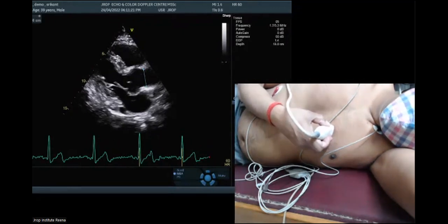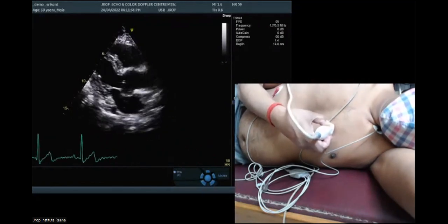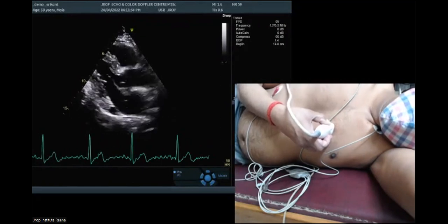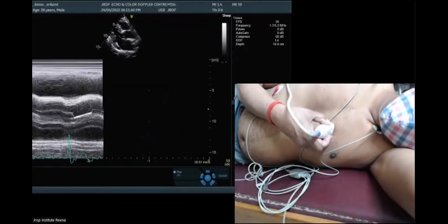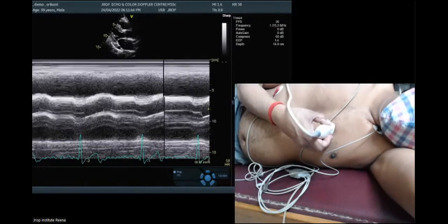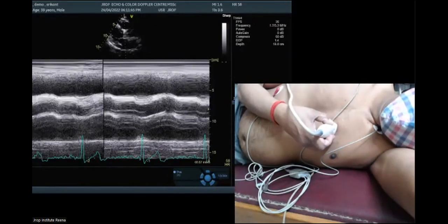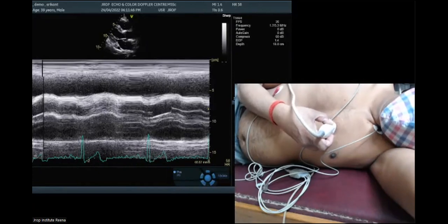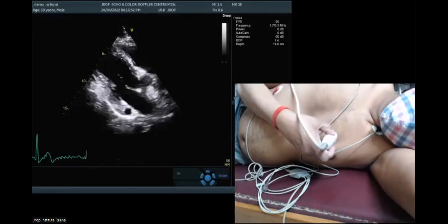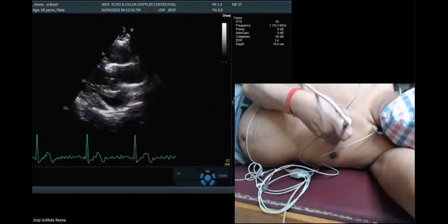In fact, exceptions come sometimes, like when I teach, although I can say this is not published in guidelines, or I have not published it a number of times. So if I'm doing this M-mode measurement of LA, correct? This is M-mode. It's not a very clear picture. Let me just try to make this M-mode a clear one.